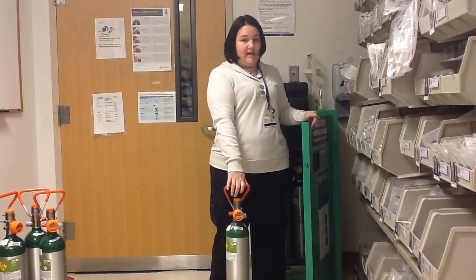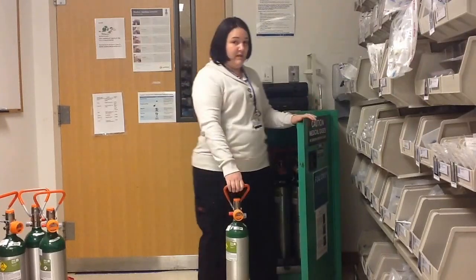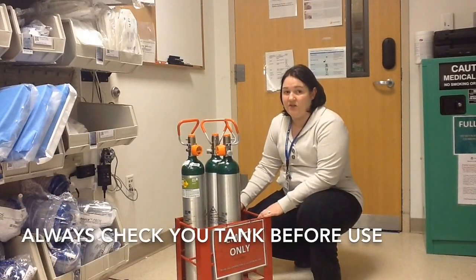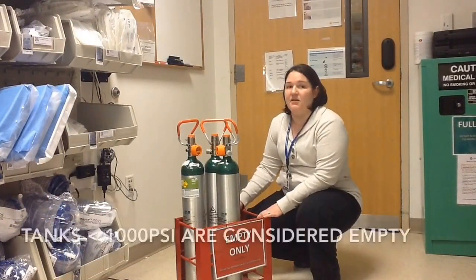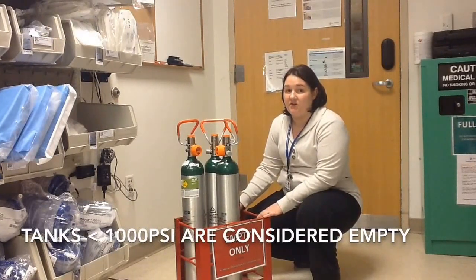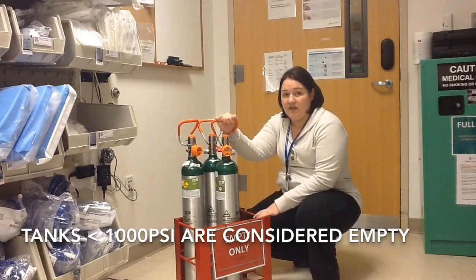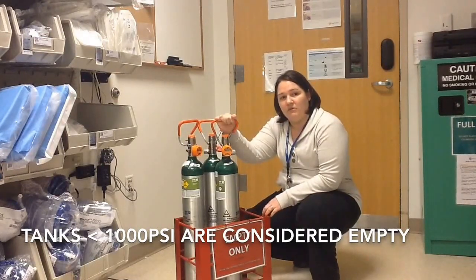Once you take a tank out of here, do not put it back. It's considered now in use. Once the tank is used, it can go in here. If you're reaching for a tank, you want to make sure that it has above 1000 psi. Once a tank has 1000 psi or less, it is considered empty and do not use it. It's put in this bin here, and it'll be refilled the next morning.